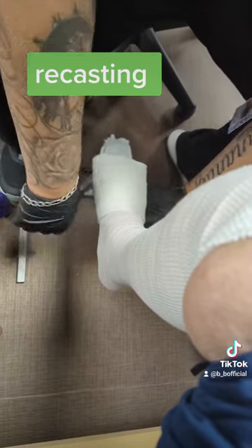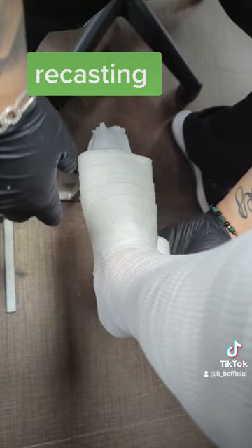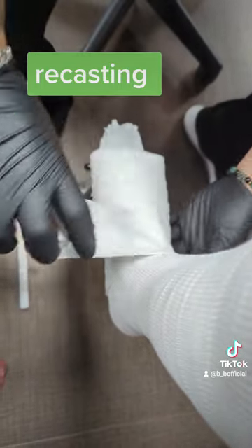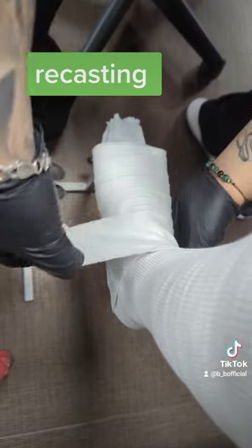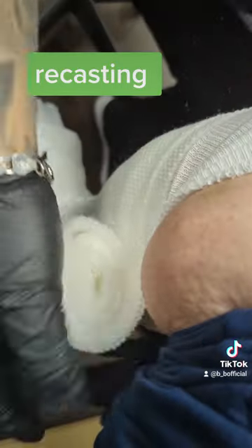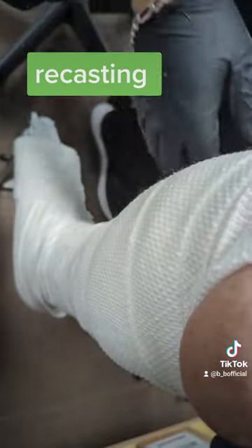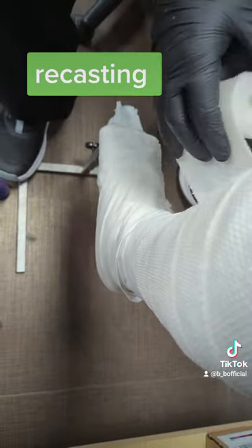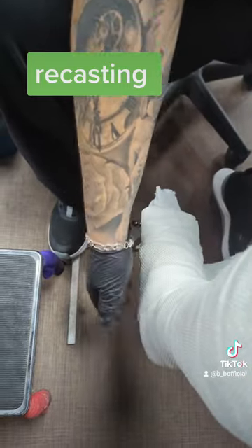He put a compression sock on first. Then he's adding padding so it doesn't cause any pain, rubbing, or discomfort with the cast. Now this third part is orthopedic padding — it's a lot thicker. You gotta love his tattoos, right?